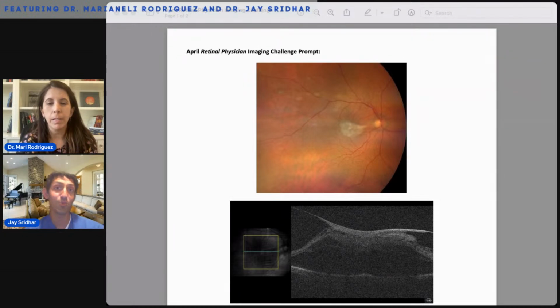Now, that's a little too much for my taste. I'm a little more conservative. But here I would lift the hyaloid, I would peel the ERM. And then if the periphery looks normal and the hyaloid has come out nicely, I wouldn't shave. I would just clean up what's accessible to me with each hand. I usually like partial air because I like that just to check my sclerotomies, and I will get out.